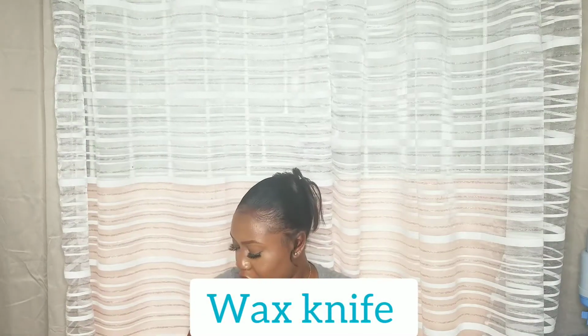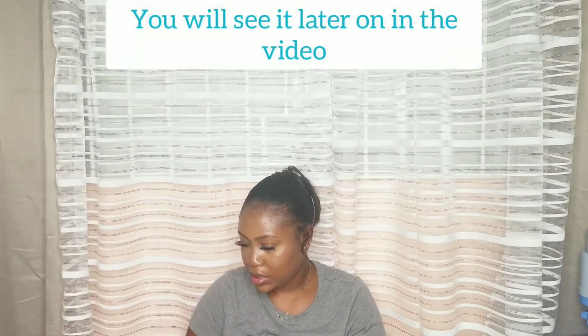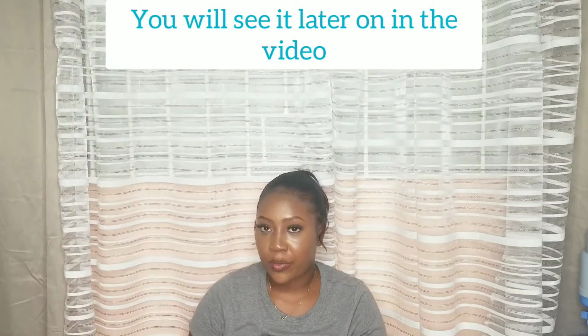But let me just use this paper to show you guys better. Hopefully this will be better. So this is what it looks like. Mine is all burnt up because I've been using it, but basically you use this to cut the wax to carve the teeth. So first semester you're definitely going to need that. I think there's something else but I'm missing it. I don't remember right now, but definitely you're going to need a carving kit.